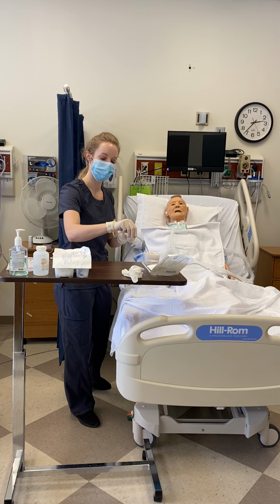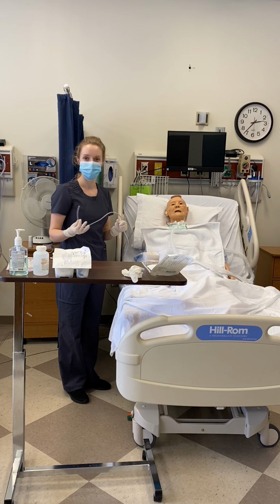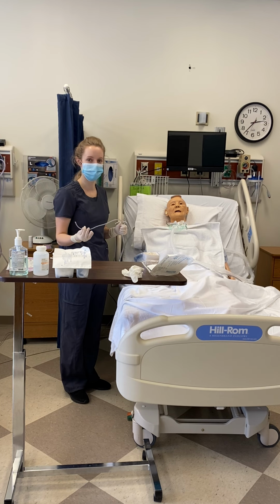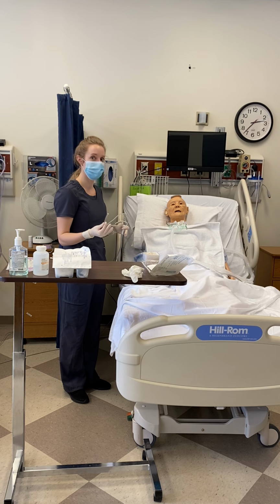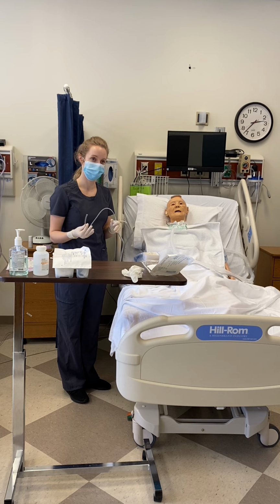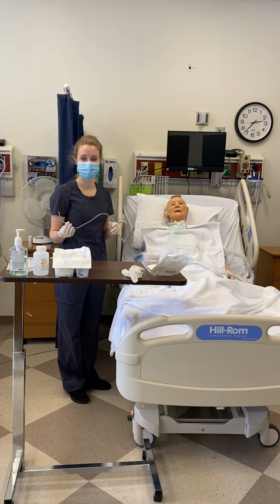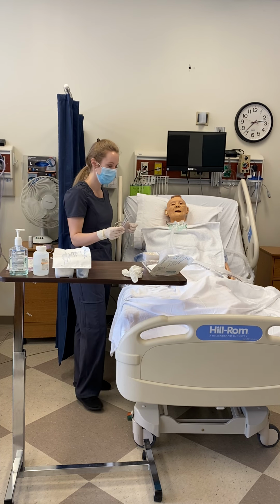And then suction some saline to clear this out. And then I want to assess Mr. Smith. Allow 2 to 3 minutes between suctioning if I can, if he's not in respiratory distress. I could check his pulse, his respiration rate, look at him for signs of deoxygenating or respiratory distress. I could also give him some more oxygen now if needed.